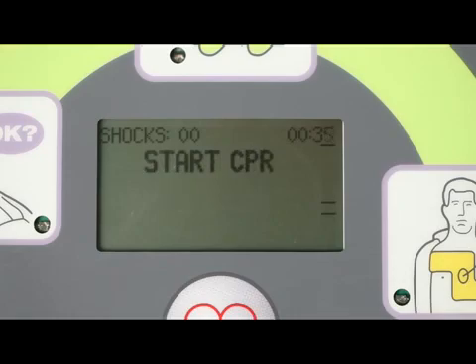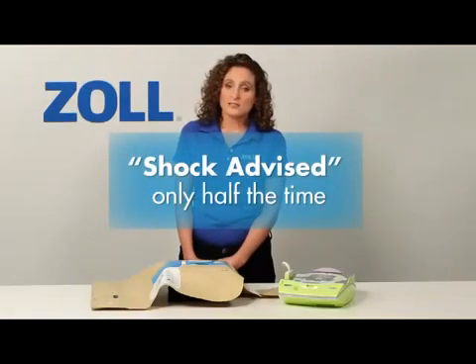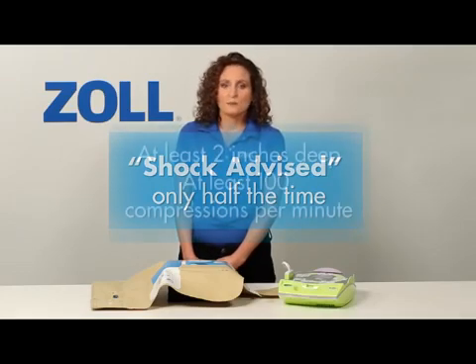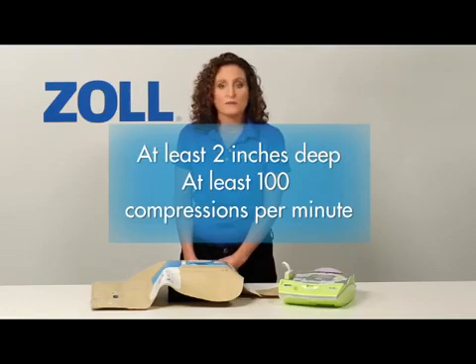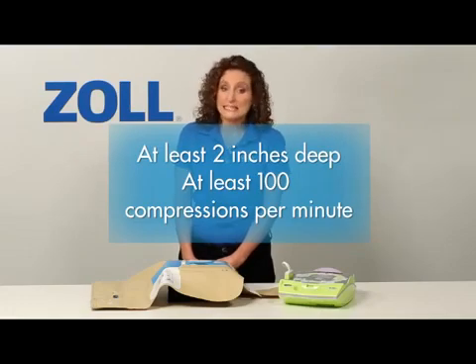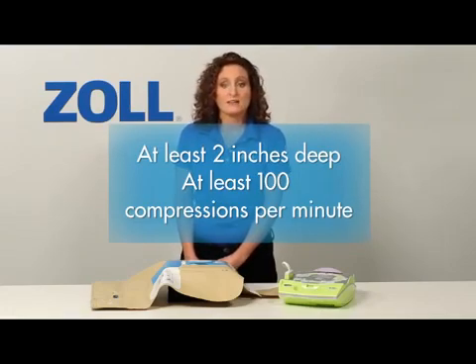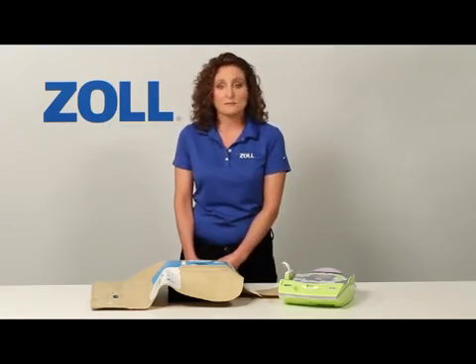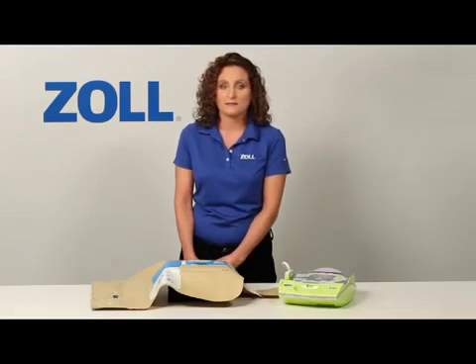Start CPR. Half of all rescues with an AED start with no shock advised. Perform good CPR with chest compressions that are at least 2 inches deep at a rate of at least 100 per minute, and the next analysis may tell you to deliver a shock.